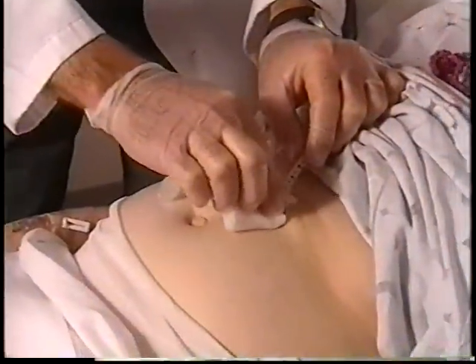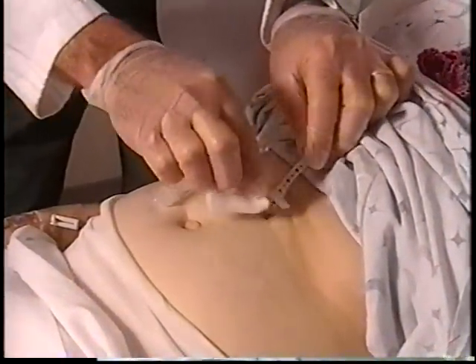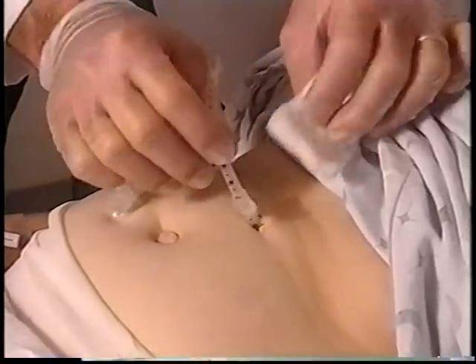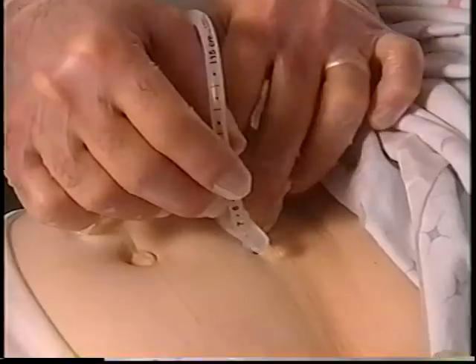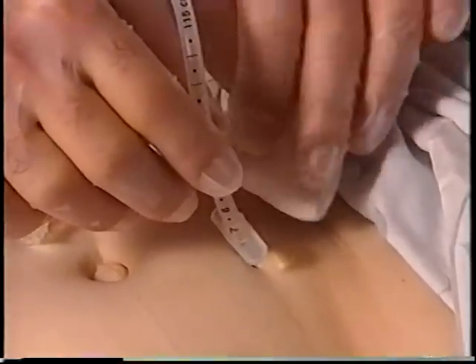The stoma, or skin entry site for the PEG tube, should be cleaned daily. Initially, hydrogen peroxide on a cotton swab or small piece of gauze may be used to clean around the site. During the cleaning process, the tube should also be rotated to ensure that it moves easily in a full circle. If it does not, the physician should be notified.